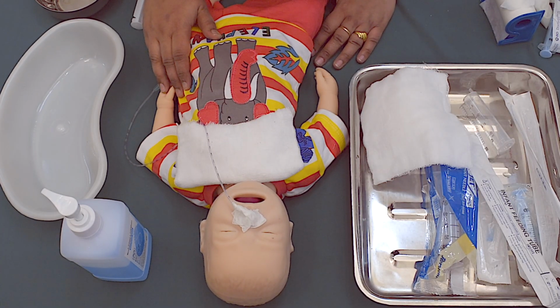After giving the feed, we can keep the baby in the right lateral position or in semi-Fowler's position, as the baby is comfortable. Now do recording and reporting and wash your hands.